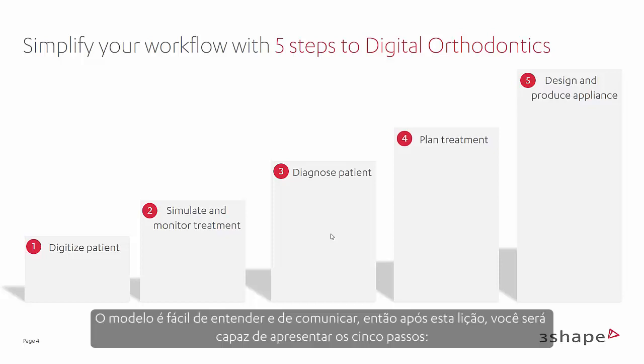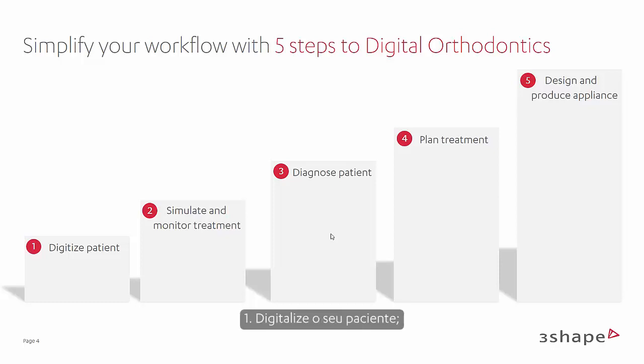The model is easy to understand and communicate, so after this lesson you will be able to present the 5 steps. 1. Digitize your patient. 2. Simulate and monitor the treatment. 3. Diagnose the patient. 4. Plan the treatment. And finally 5. Design and produce the appliances.